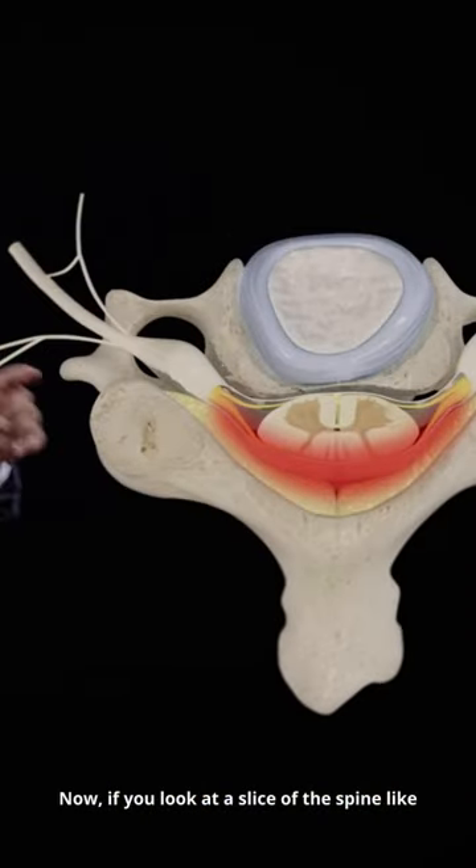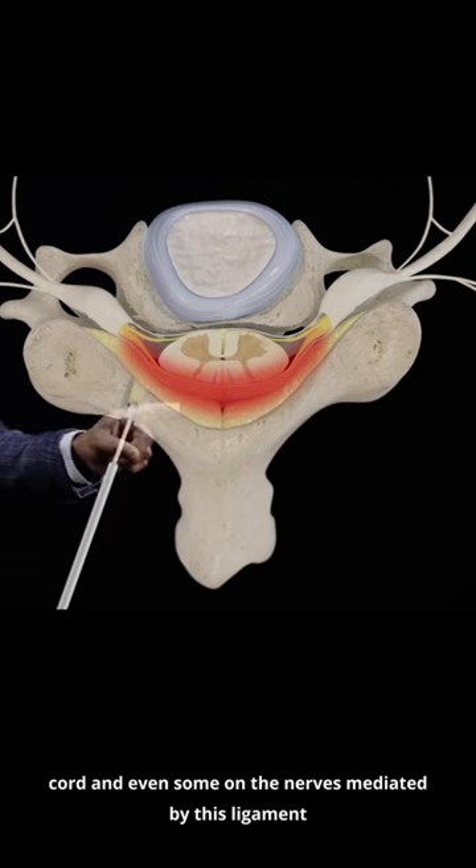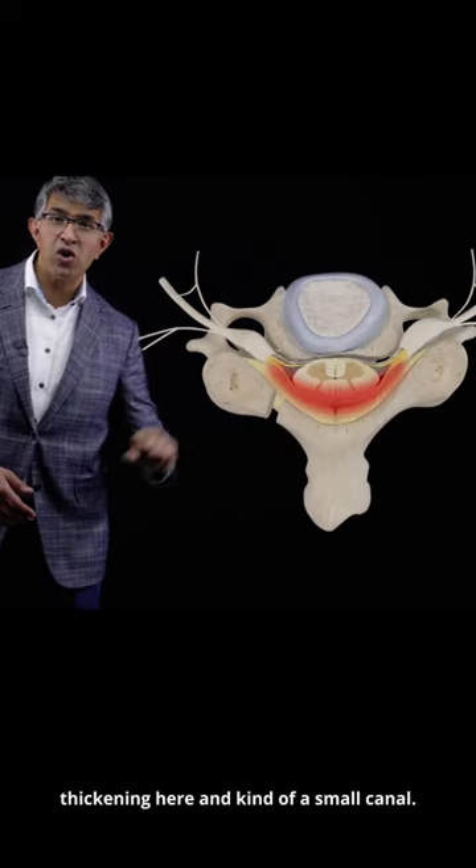Now if you look at a slice of the spine like this, you can see how there's some pressure on the spinal cord and even some on the nerves, mediated by this ligament thickening here and a small canal.